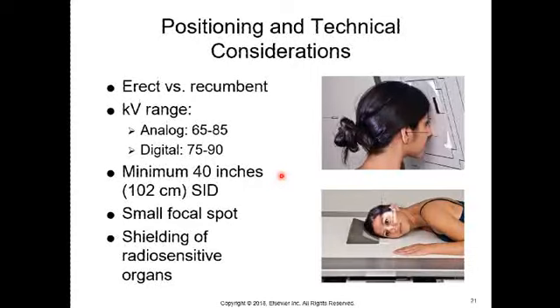The only thing that changes is your central ray, where it enters and exits, because cranium is up higher and your facial bones are clearly lower on your skull and on your head. Anyway, positioning and technical considerations. You need to keep in mind erect versus recumbent.